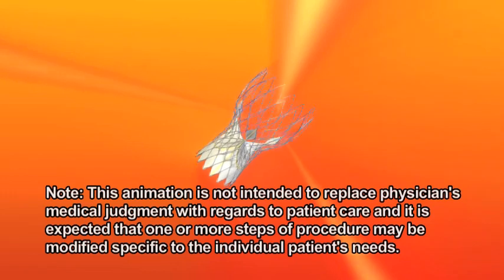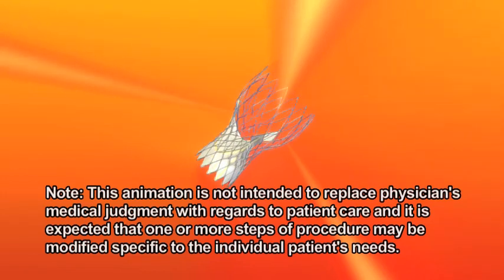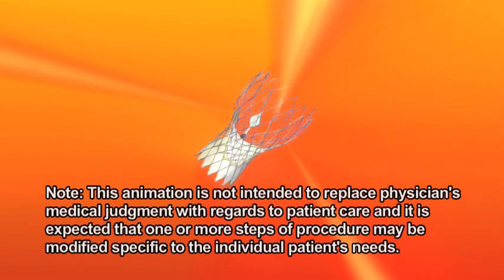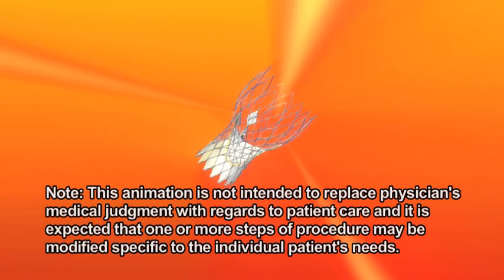Please note, this animation is not intended to replace physician's medical judgment with regards to patient care, and it is expected that one or more steps of procedure may be modified specific to the individual patient's needs.